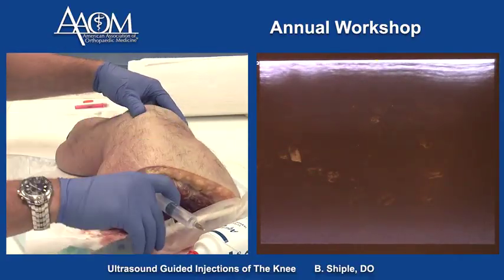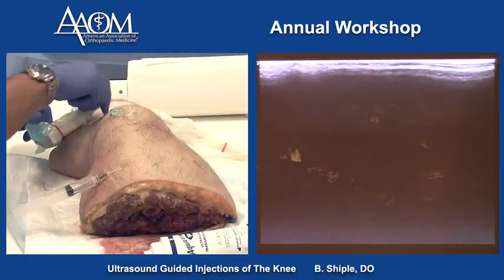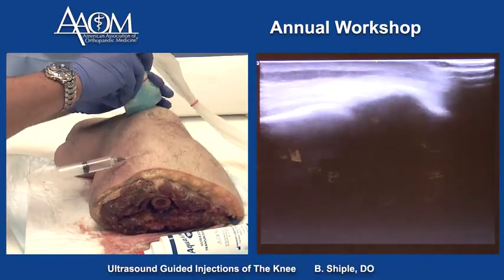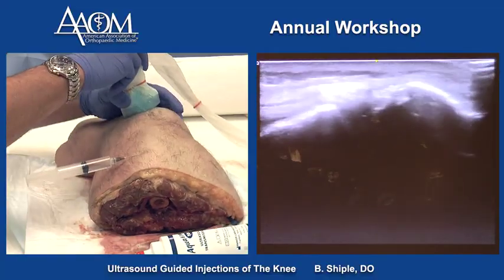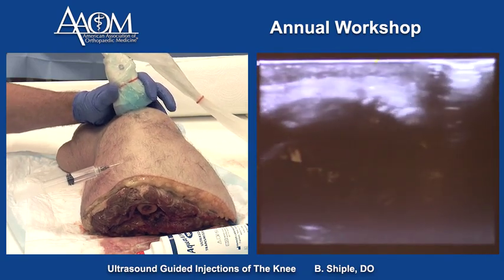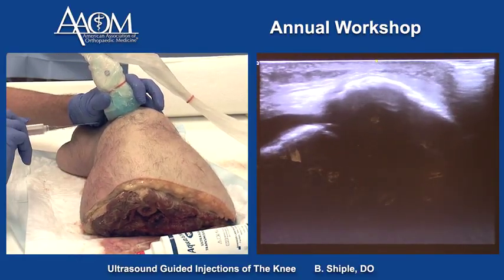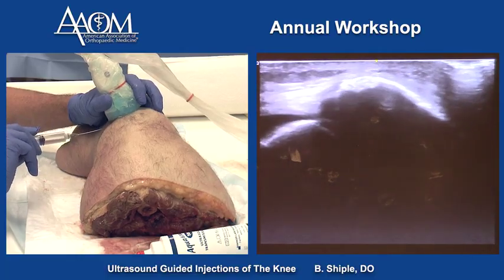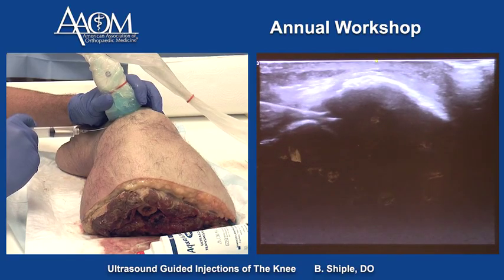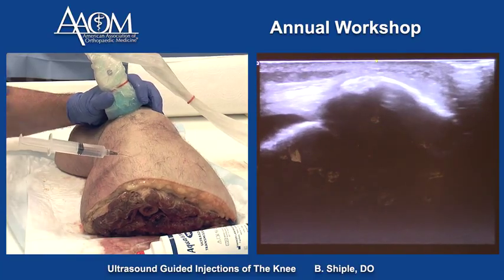The next technique is the modified Jackson technique using ultrasound. The patient is lying on their side. I would use this technique if the joint space in the suprapatellar pouch was just not cooperating. We put the probe over the lateral patellofemoral joint space, sublux the kneecap laterally to open up the potential joint space, slide the needle underneath the probe, and we're in the joint. It's a good fallback technique when you're struggling to get into the suprapatellar pouch.